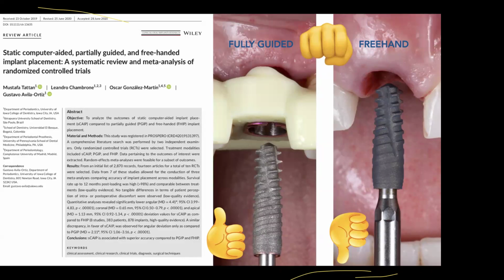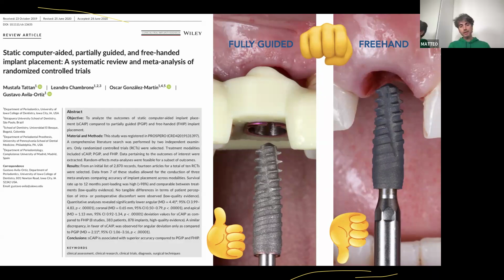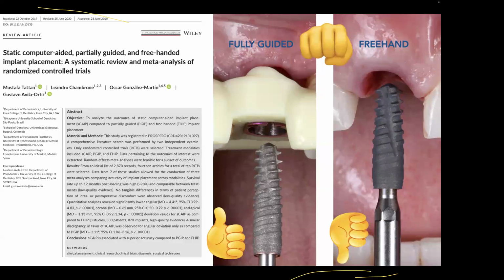And the guide has to be placed in the very right position, because if not, all the surgery is altered, and the position of the implant could also be influenced by the misfit of the guide.